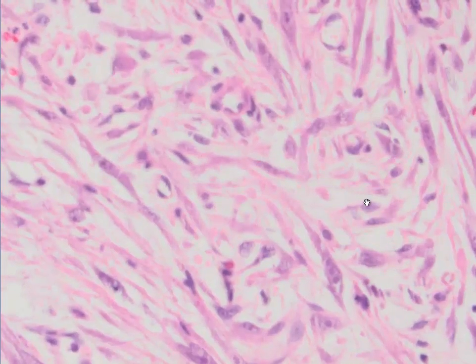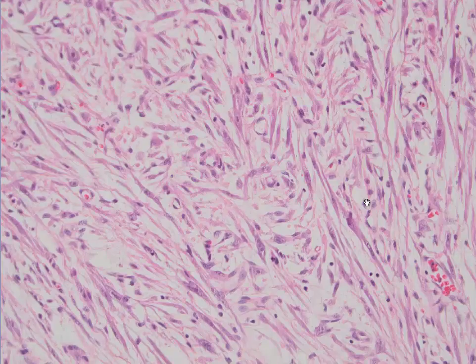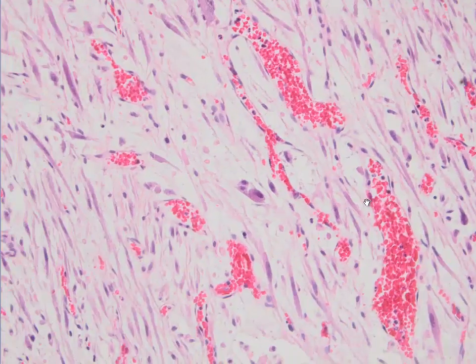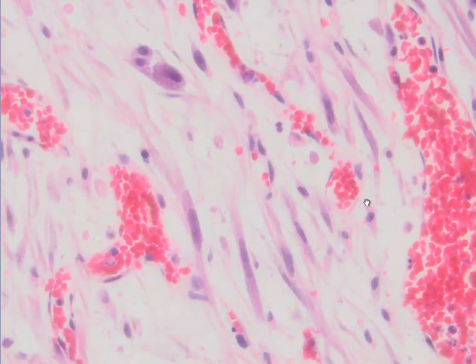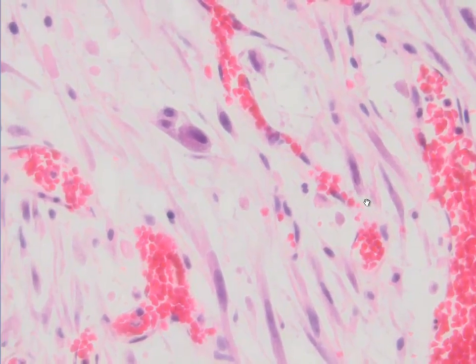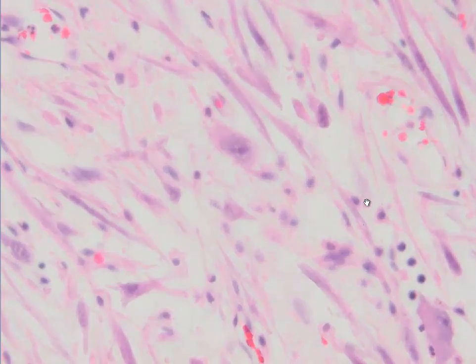The cells are accompanied by inflammatory cells, and we see some ugly looking, hyperchromatic cells. There are some ganglion-like cells here.